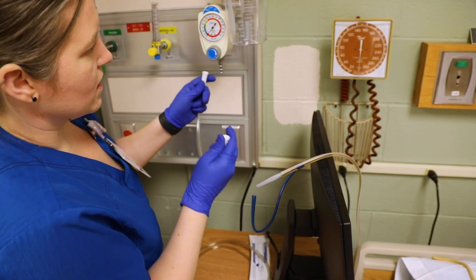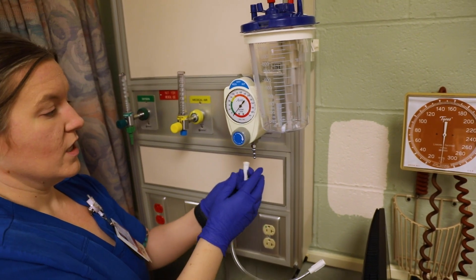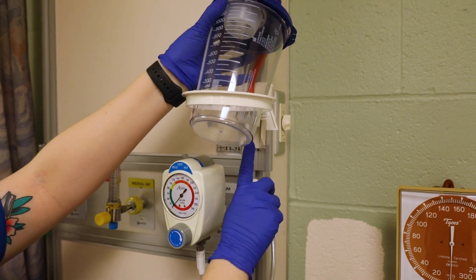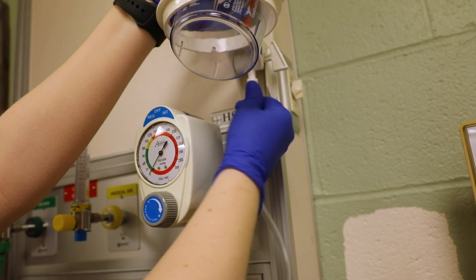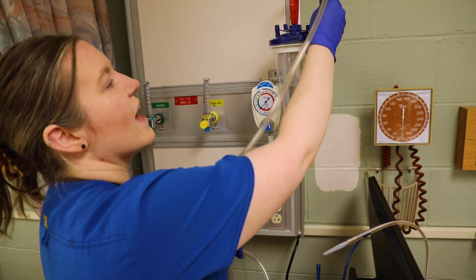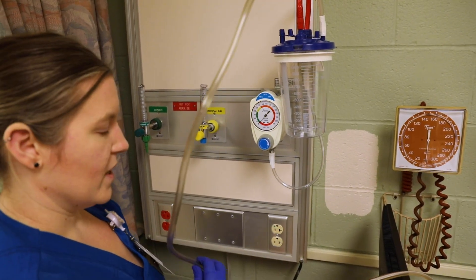You want to connect the canister with the actual regulator. There's a little part down here that you connect. And if you look up here — I'm going to lift this for a minute so you can see — there's this little hole right here you can connect it to. Then you're going to take whatever suction tubing you have for the patient and connect it right there.